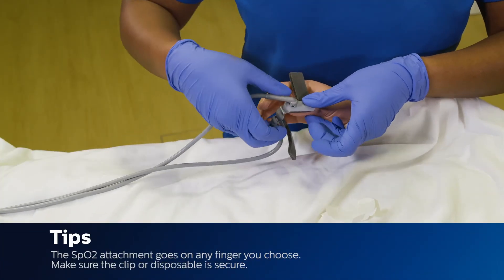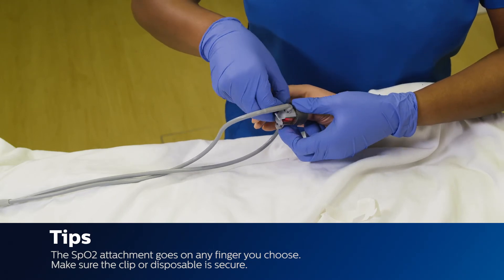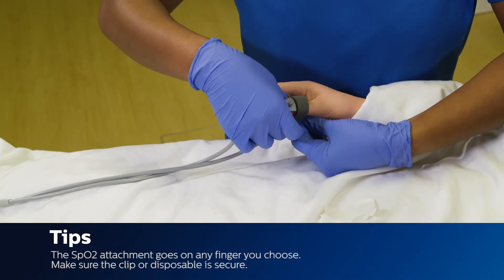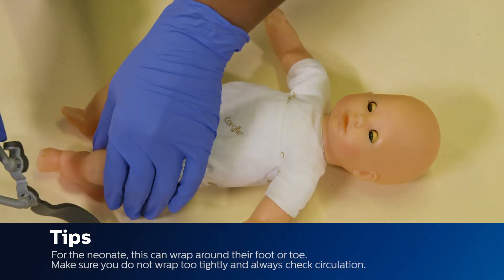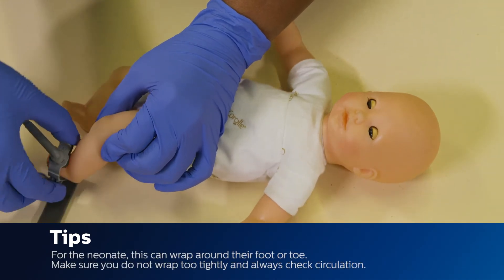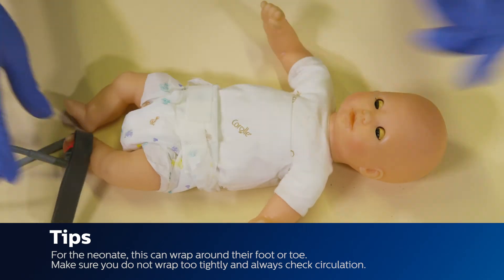Tips: The SPO2 attachment goes on any finger you choose. Make sure the clip or disposable grip is secure. For the neonate, this can wrap around their foot or toe. Make sure you do not wrap too tightly and always check circulation.